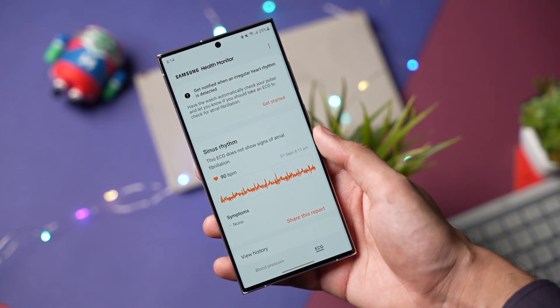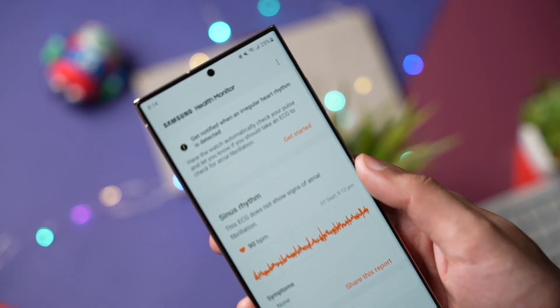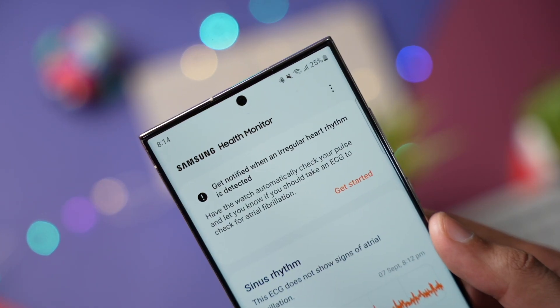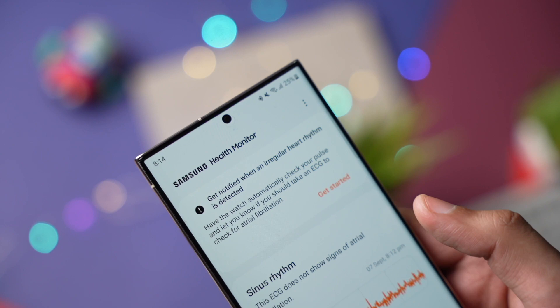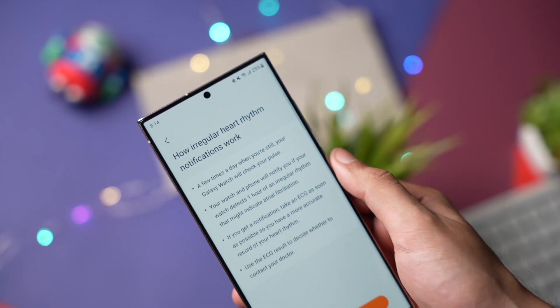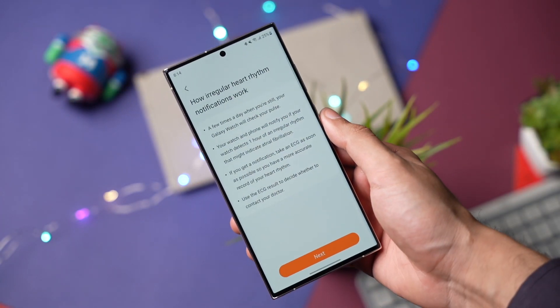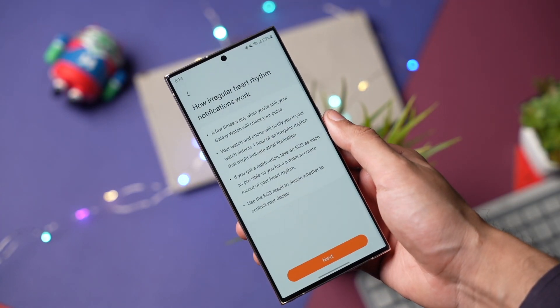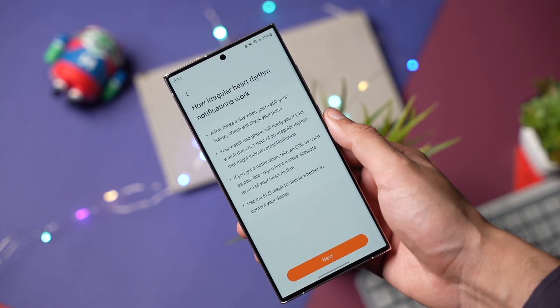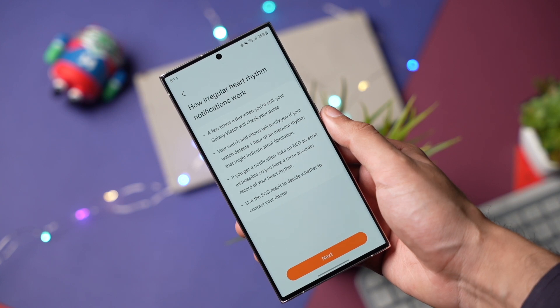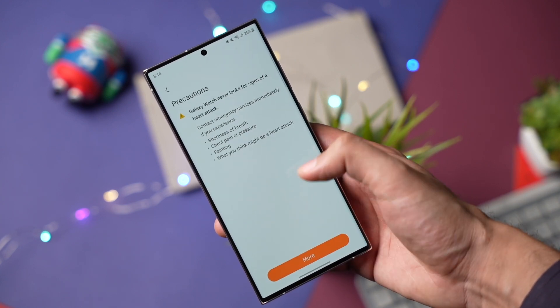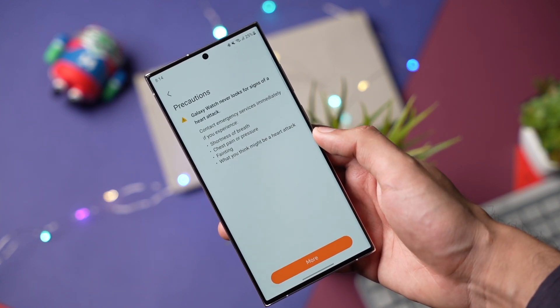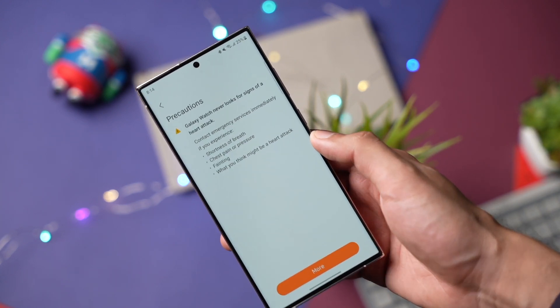Under the ECG section, you will see a banner that says 'Enable Irregular Heart Rhythm Notification System.' You can read more information there about how it will work, and that's it — your watch will now look for irregular heart rhythm in the background.